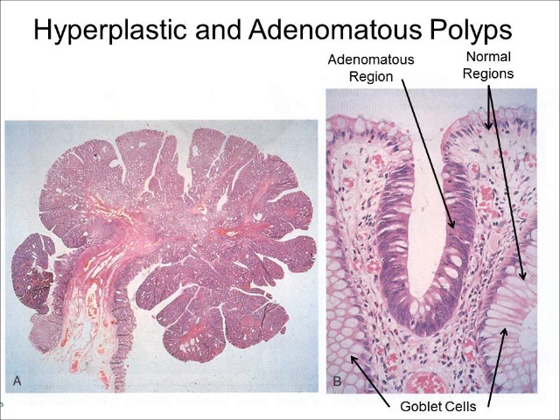The second type is an adenomatous polyp, and this is of greater concern. Such polyps contain dysplastic epithelium, that is, the cells are not quite normal. An example of dysplasia is indicated in the right-hand figure labeled adenomatous. When you compare this region to the normal regions, you will note that it is darker staining, the nuclei are more elongated, the nuclei are not just located at the base of the cells, and there are fewer goblet cells. If the polyp contains regions such as this, then it is defined as an adenomatous polyp.